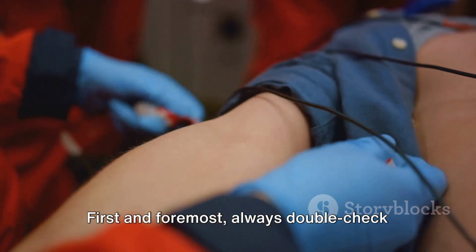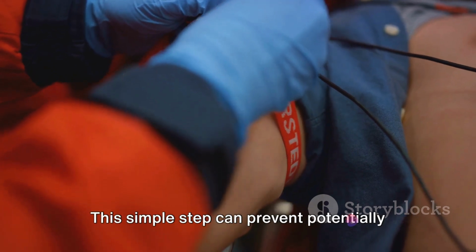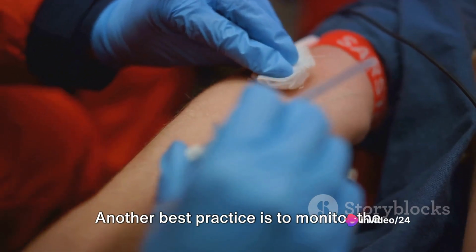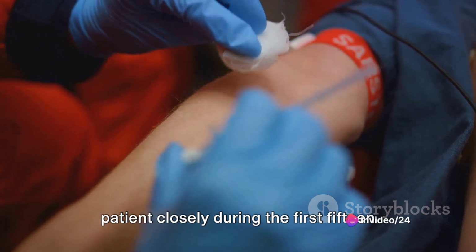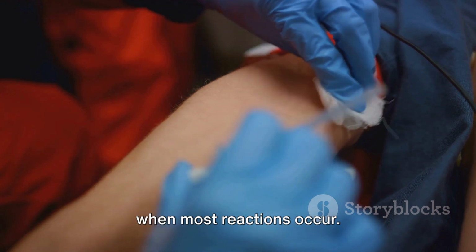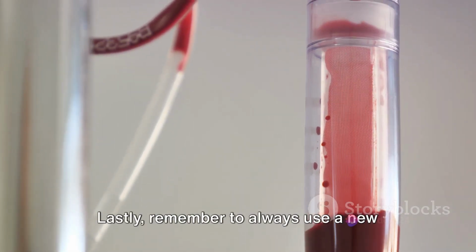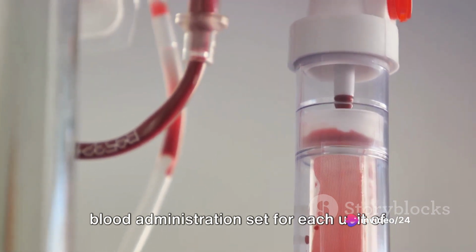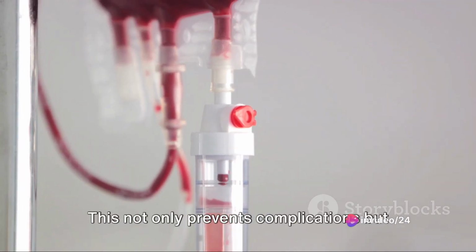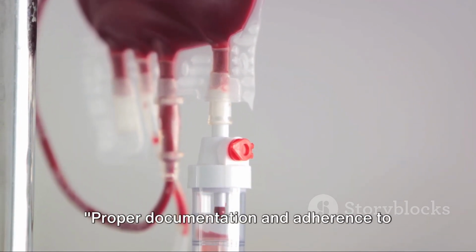First and foremost, always double-check the patient's identity before initiating the transfusion. This simple step can prevent potentially fatal mistakes. Another best practice is to monitor the patient closely during the first 15 minutes of the transfusion, as this is when most reactions occur. Lastly, remember to always use a new blood administration set for each unit of blood or blood component transfused. This not only prevents complications, but also ensures the accuracy of your documentation.